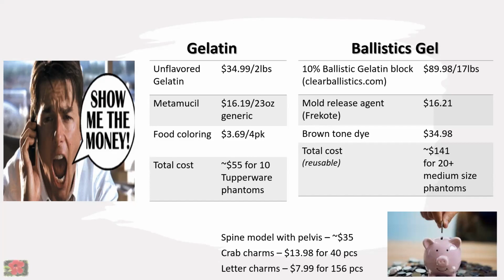I use a needle and a syringe, but if I already have an umbilical catheter inserted, then I inject in the umbilical catheter directly, and it leaks from the umbilical catheter to the vessel and fills it up. Before I store it, I typically take all the fluid that I injected out, just because it is food color, so I don't want to leave it there. And with the vessels, sometimes immediately before the workshops, I would put the metal straws again inside the vessels that were already made there, just to make sure it's patent and I will have no issues with it. And so far it's working, as I mentioned, for over 2 years now.